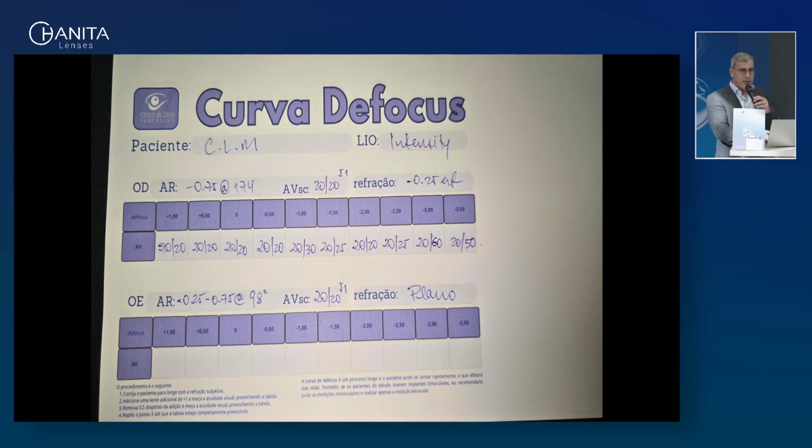It's very interesting because this IOL is refractive for the intermediate vision. It's not unusual, when you're doing the test and taking out the power, for patients to refer to -2 as the best vision in the test so far. The patients go, oh, now it's very good, because it's refraction at this point.